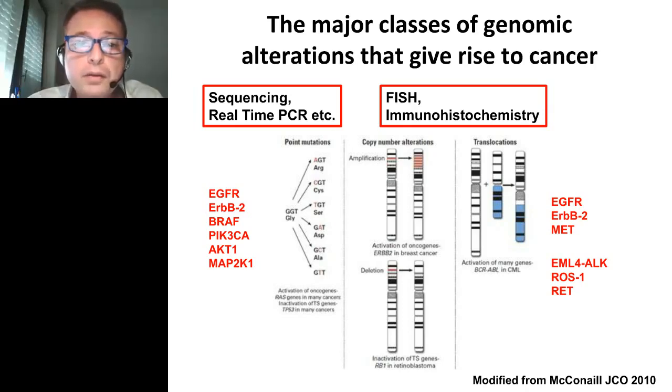Now, the main difference between genotyping and next-generation sequencing is that genotyping allows only to identify the point mutations or small indels, and in particular only known mutations. In contrast, next-generation sequencing can identify known and new mutations in all the regions of the DNA that are amplified, so can provide much more information.